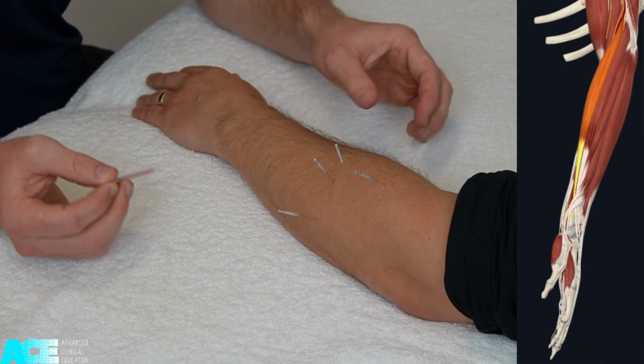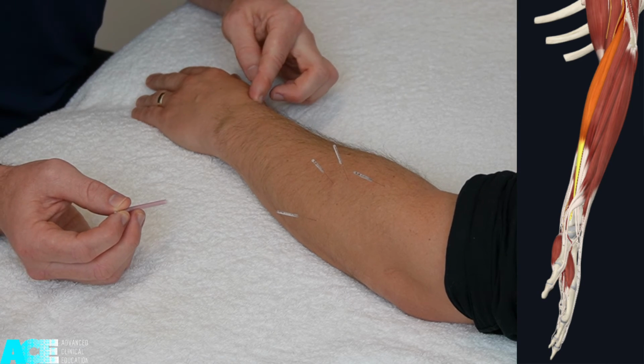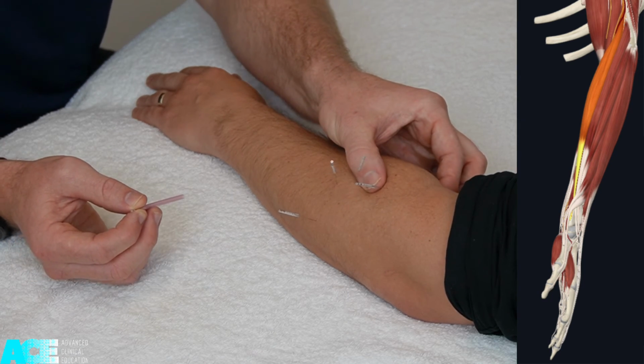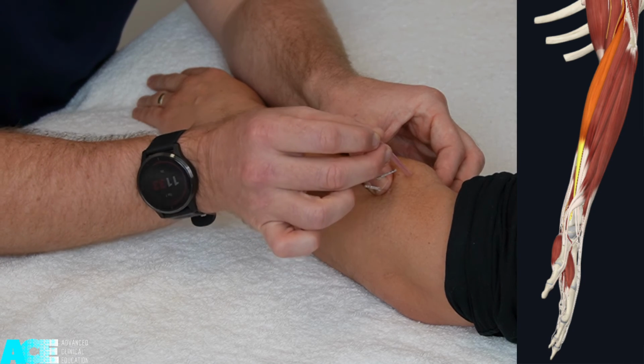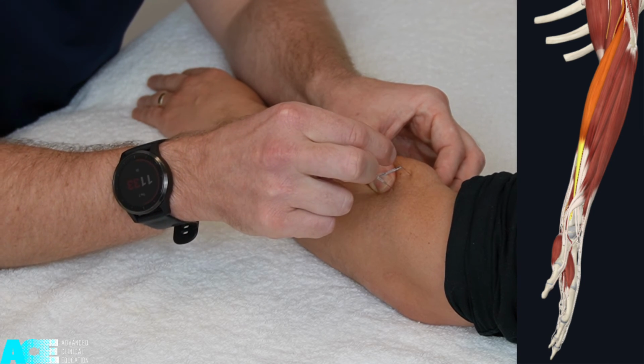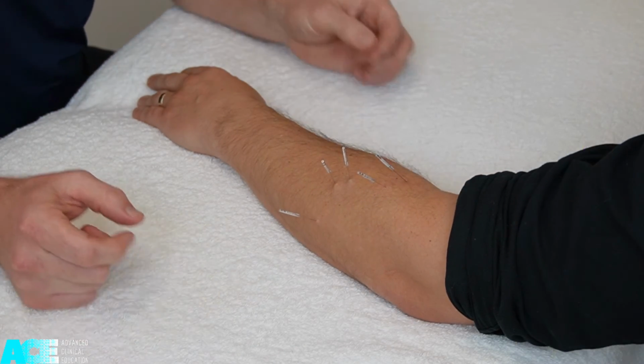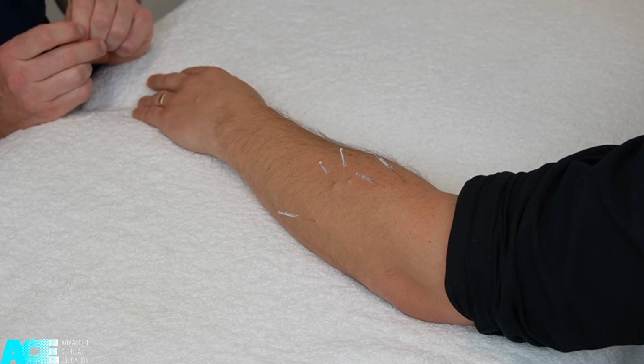An additional muscle that can be needled in this position is the brachioradialis muscle. This muscle originates from the supracondylar ridge of the humerus. We can use a pincer grip palpation directing our needle towards our finger on the opposite side. This will keep us well clear of the underlying radial artery.